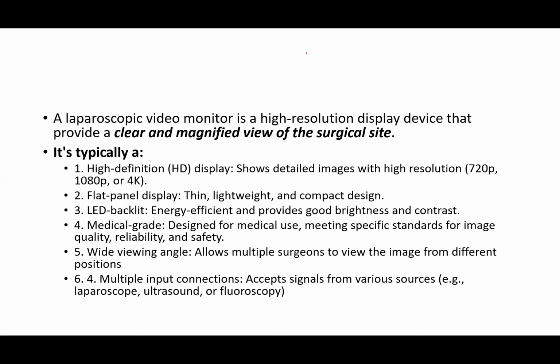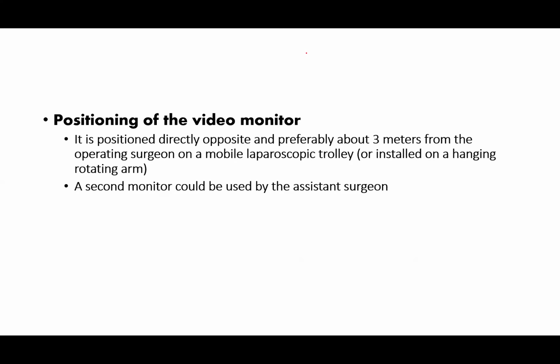Okay. Now, multiple input connections. It should accept input from various sources. You shouldn't have a monitor that has just one type of connector, maybe a USB. It's not compatible with several other devices.